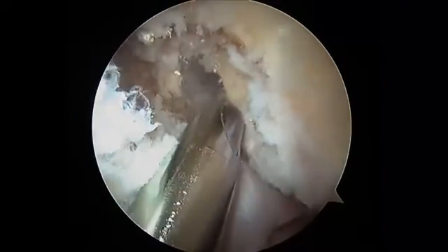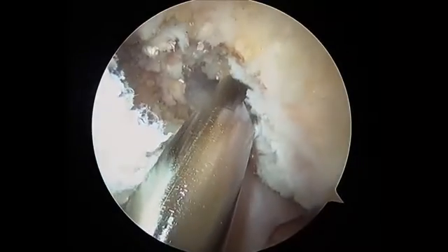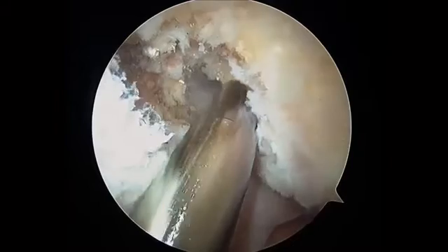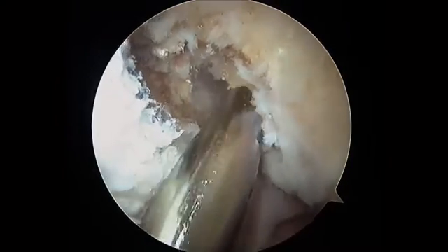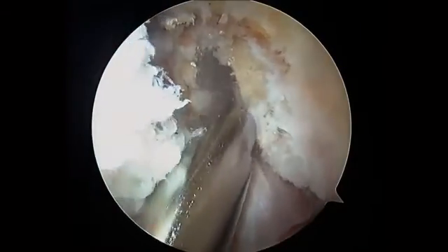Definitely anatomic, and we're in a low tension zone. So we feel that this portion of the footprint is functionally more important and better to reconstruct than this portion of the footprint, or even a central portion of the footprint.